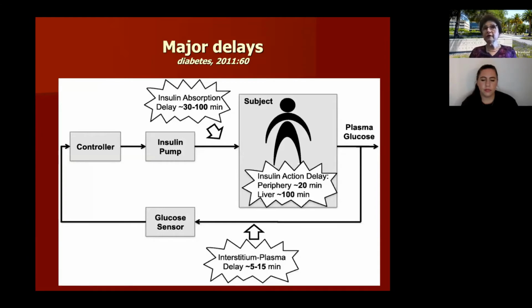If blood sugar usually doesn't spike by at least 30 to 50 points, then you're likely to be low in the next 2 to 3 hours, 3 to 4 hours, because this whole process is not covered by insulin given subcutaneously.